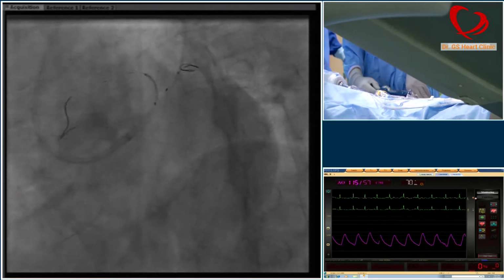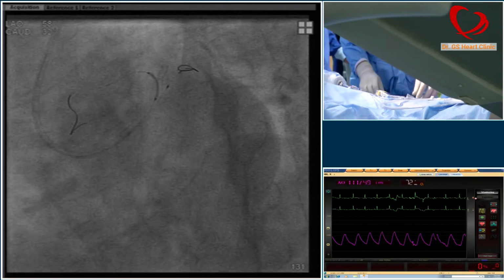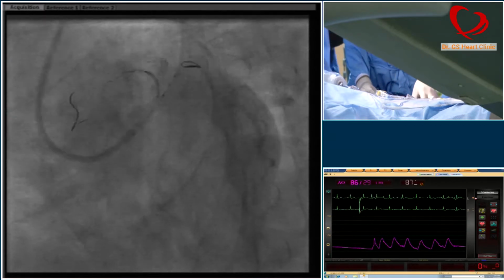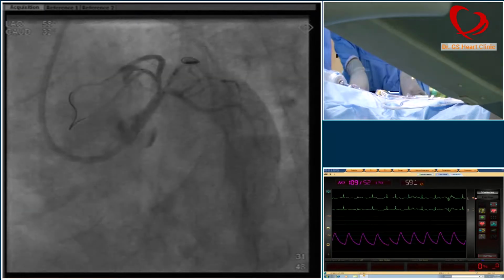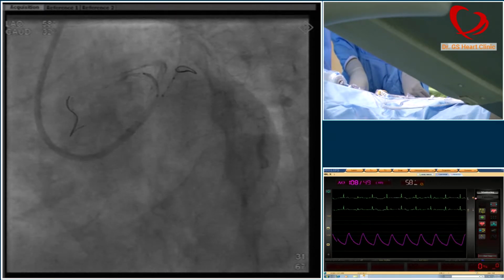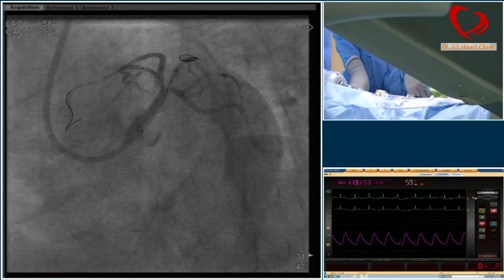Okay, now give me. Wait, get the balloon. Negative. This one. Very small test. Into this also. Store it and show, please. I think we are okay.